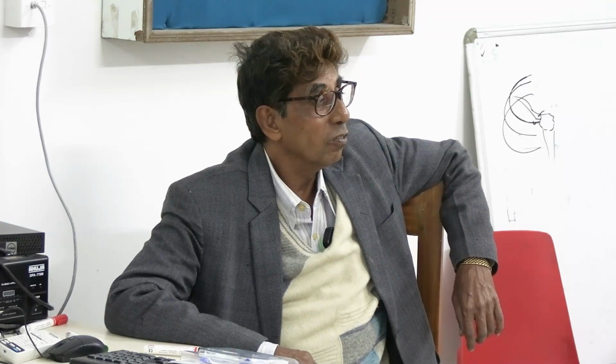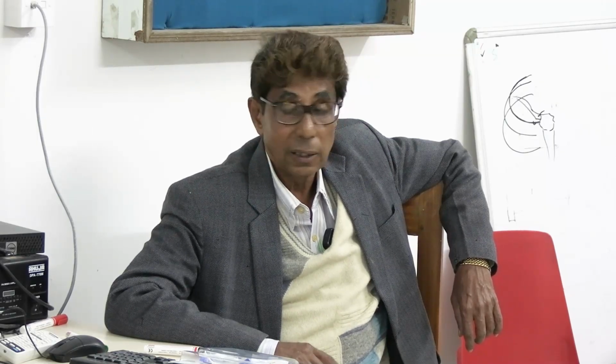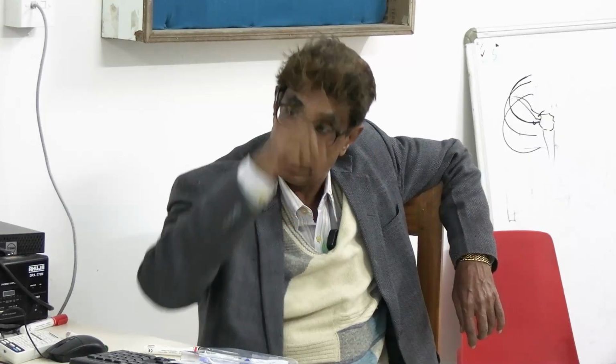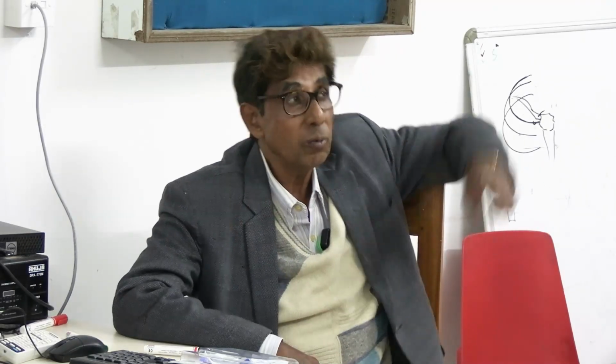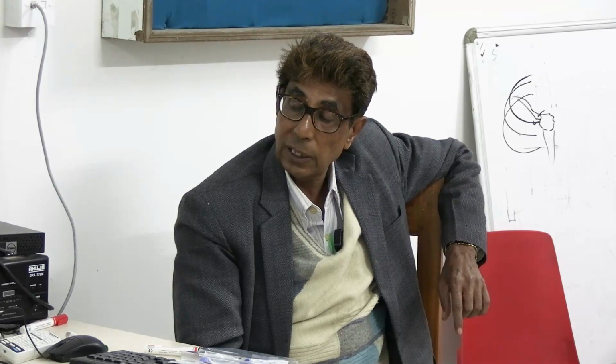And a prominent V wave here, remember, is related to the tricuspid valve. If there is a leak in the tricuspid valve, more blood will come. Venous return তো হচ্ছেই, তার সঙ্গে এদিক থেকেও লিক করে ব্লাডটা এট্রিয়ামে যাচ্ছে, তার মানে আরো প্রেসার বাড়বে. That will be a very tall V wave in tricuspid regurgitation. That's a specific sign of central venous tracing.